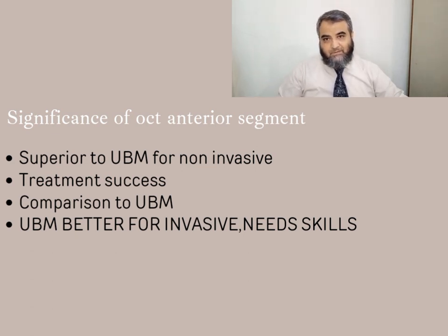It can be done by any ophthalmology technician, and it is good for non-invasive assessment. So we basically use all our modalities, OCT, UBM, and even the gold standard, a surgical incisional biopsy.